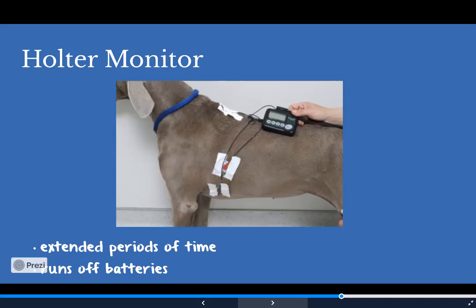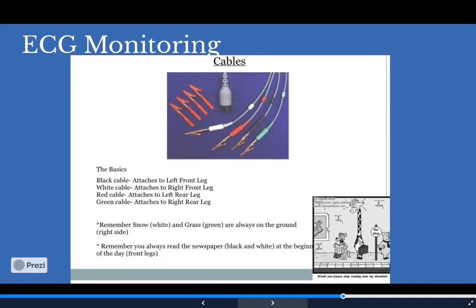Also, the nice thing is that it recorded it on the TV so that if there was something that we were questioning and our cardiologist wasn't there at the time, it recorded it so that she could be at home and go back in the recording to look at the ECG and be able to let us know if there's something really weird. Granted, we were able to say, that doesn't look right, or I think that's what it is, but then she could confirm what it actually was.